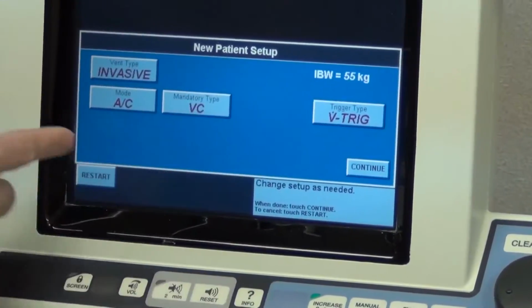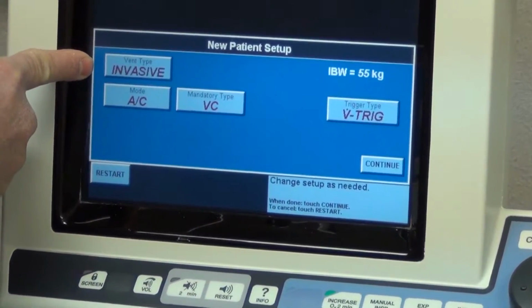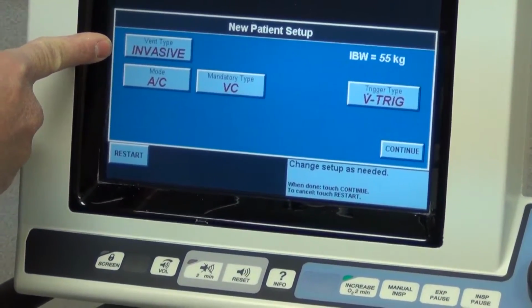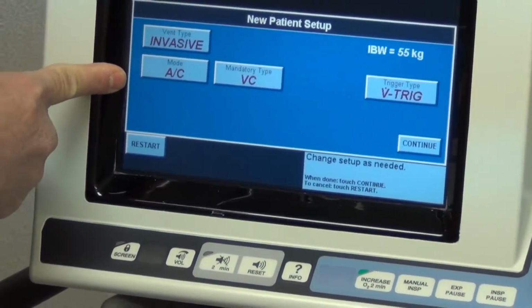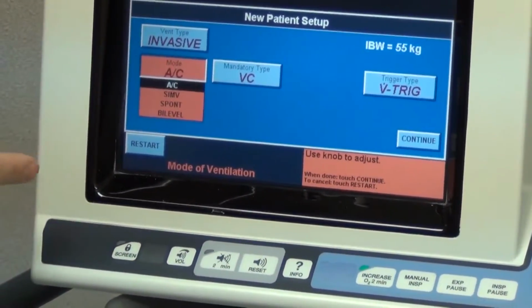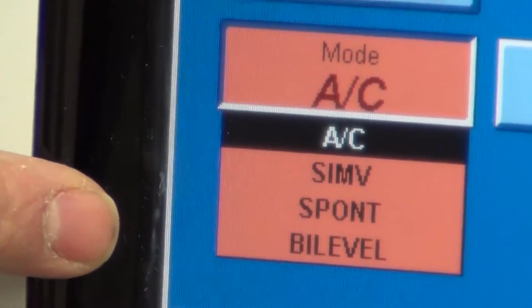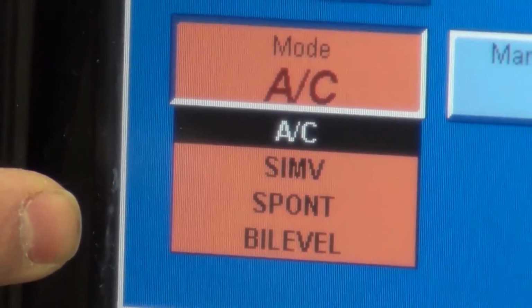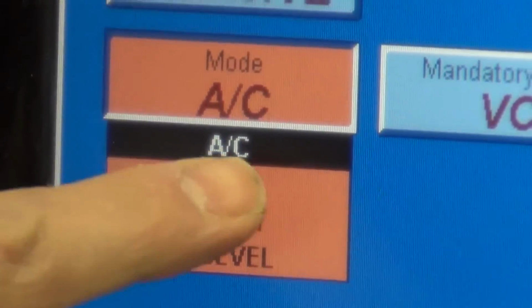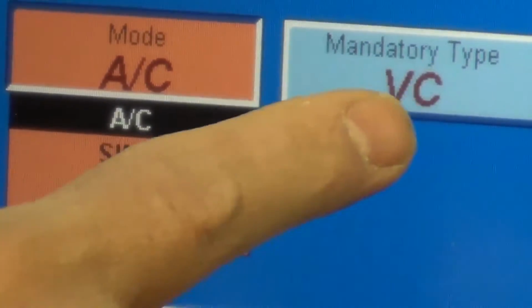This is going to be your modes of ventilation, where you first initially set up. For our purposes, it's always going to be invasive ventilation, meaning with a person being intubated with an ET tube. You're going to have a mode of ventilation. Notice when I hit it, there's different modes of ventilation. For initial setup with somebody that's going to be set up on the ventilator, we're always going to go with assist control, is what AC stands for. So we're going to keep that AC.